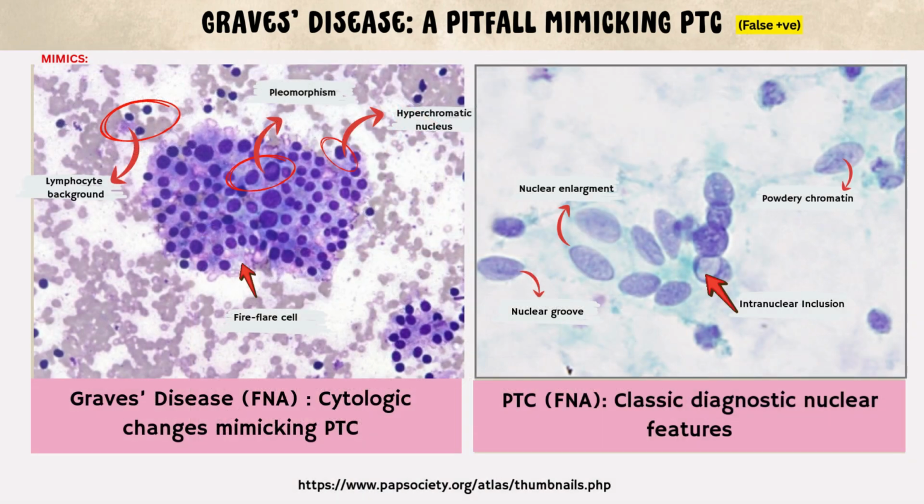Next, as demonstrated in this image, Graves' disease shows reactive cytologic changes including follicular cell pleomorphism, nuclear enlargement, flare cytoplasm, and a lymphocytic background. These findings may appear atypical, however, they are nonspecific and reactive, and do not represent true malignancy. If these features are overinterpreted, they may lead to a false positive diagnosis of papillary thyroid carcinoma.